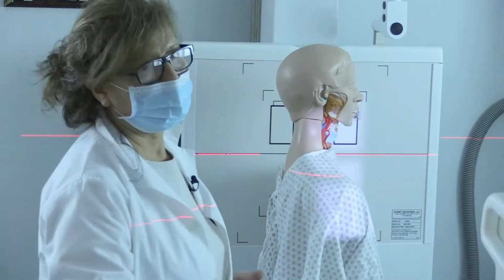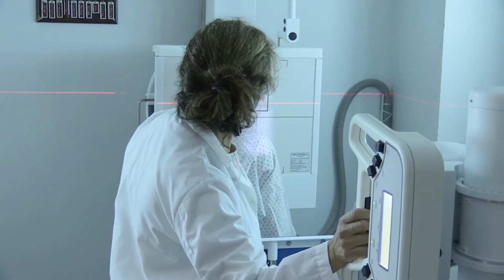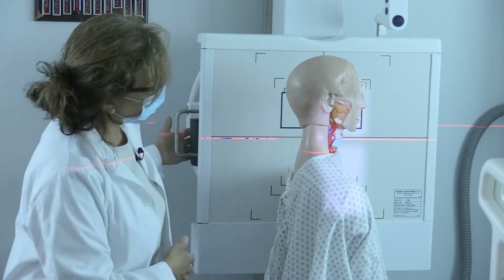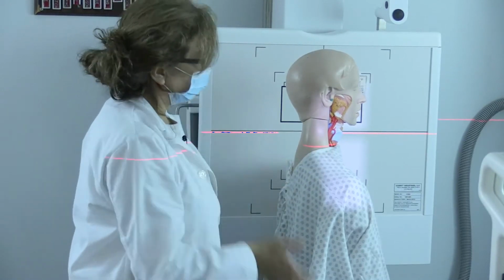So I'm going to adjust that. It's also going to be entering at the level of the mastoid tip.